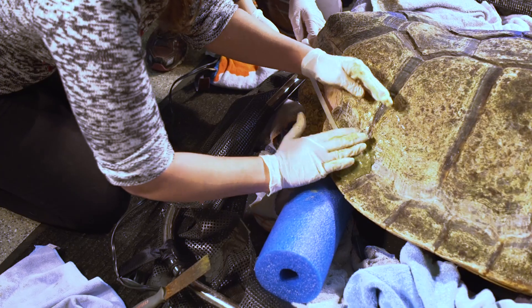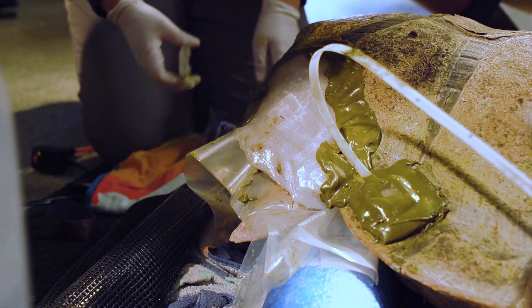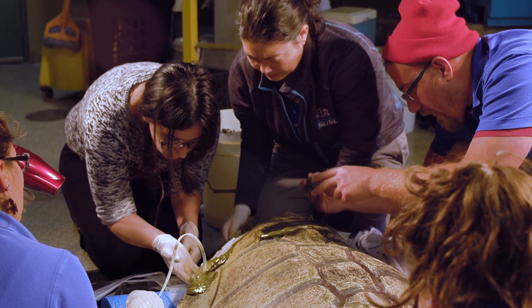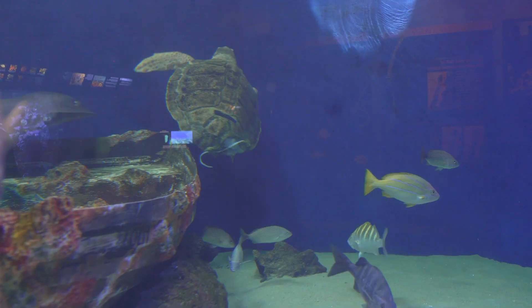The purpose of this brace is to prevent the shell from curving downwards and to promote normal growth in the future. The goal is to prevent future complications from the trauma she sustained in the wild and to keep her as healthy as possible at Birch Aquarium.